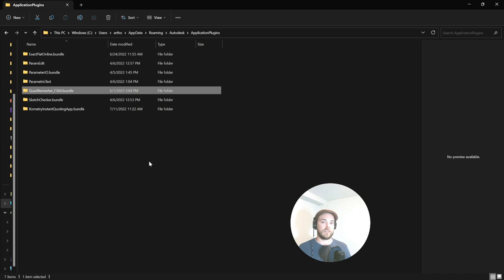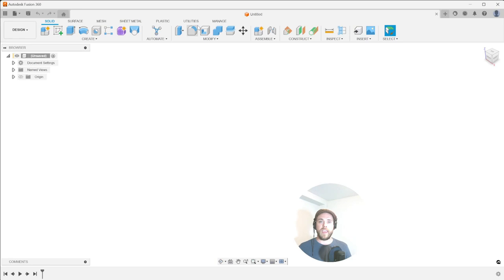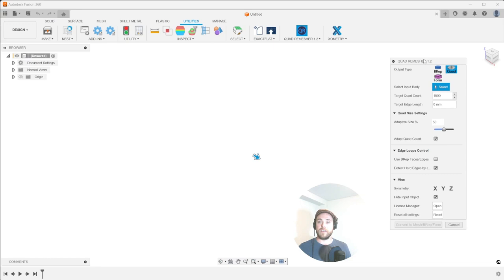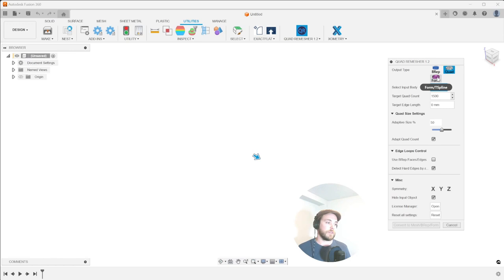Once we do that, we are now ready to open Fusion 360 and to find our brand new plugin under the utilities tab. This utilities tab has quad remesher right here, ready to go. And in here, we have the opportunity to use this to create B-reps, quad meshes, and forms or T-splines. So just an amazing plugin. And it works really well.